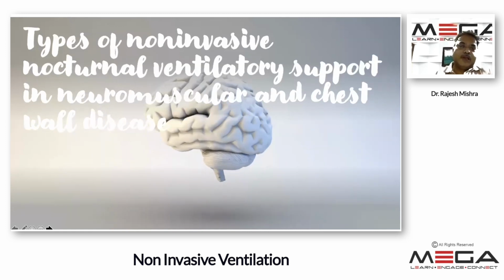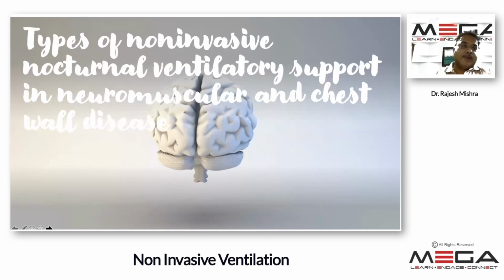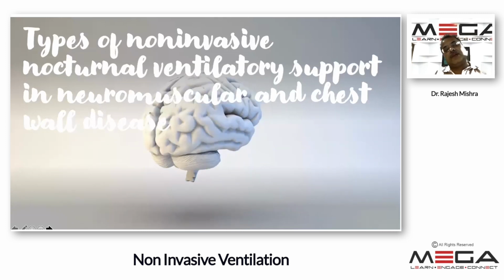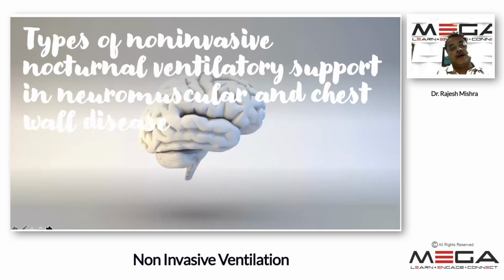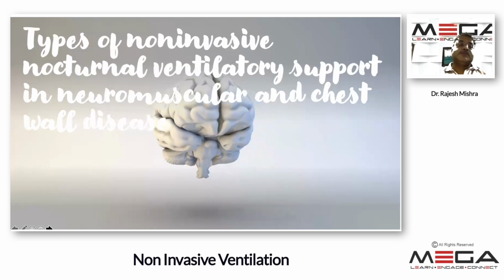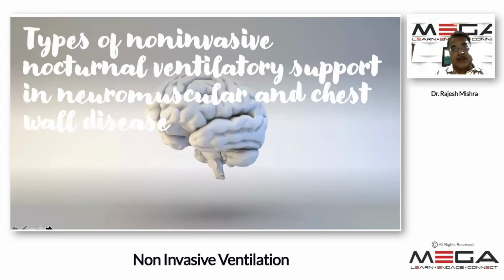helps in hospital, and most of these patients, if they have good airway, upper airway control, good cough reflex, for failing respiratory muscle, particularly respiratory muscular dysfunction in the form of muscular dystrophy or phrenic nerve injury, even diaphragmatic injury, this patient needs some form of active and passive support of the NIV.